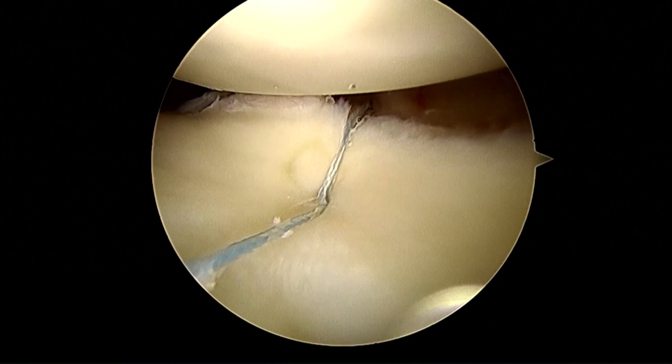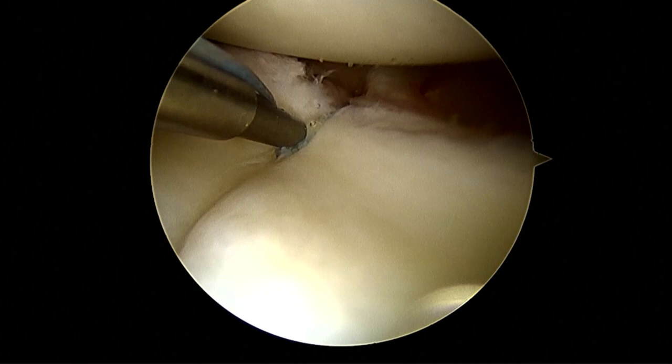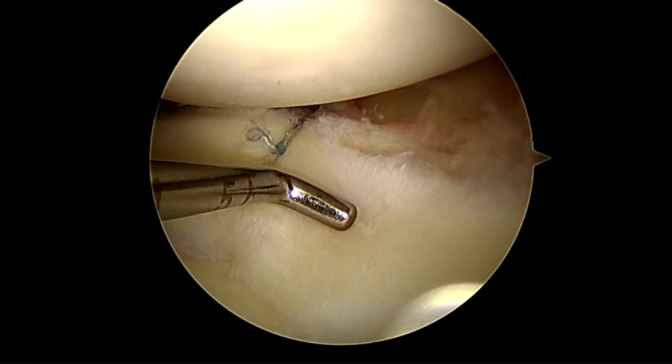Yes. Many times what happens is, after taking these sutures on the superior aspect of the meniscus, this gets elevated. So to compress that, we have to fix the meniscus on the inferior part of the meniscus also, so that this elevated part should settle down later after this.